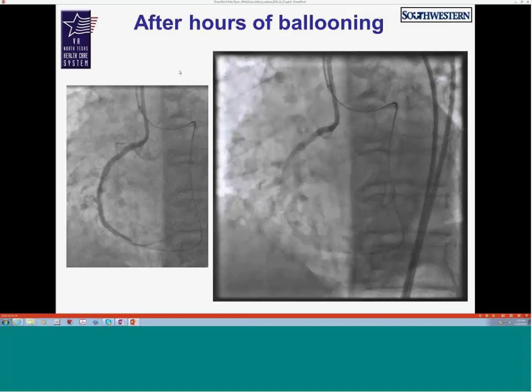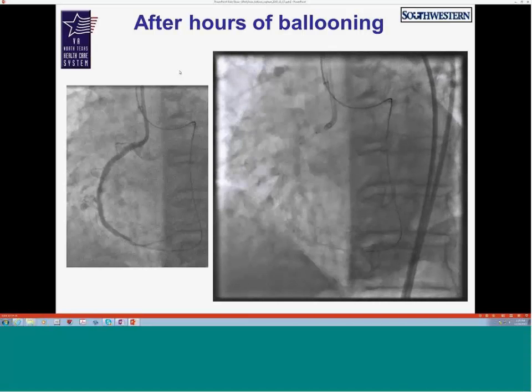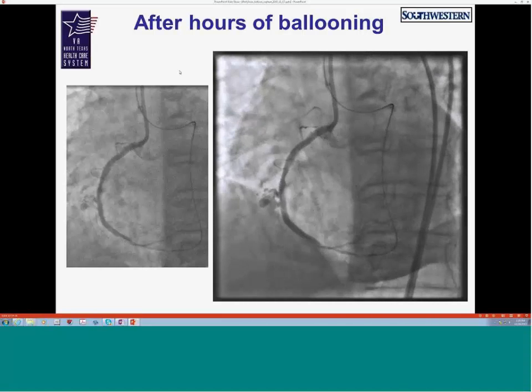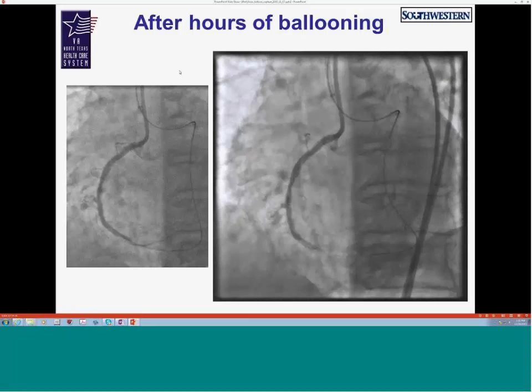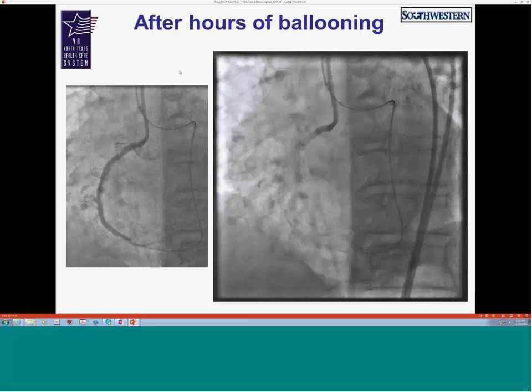So I don't know if there are any thoughts right now. We're now probably 4 or 5 hours into the case. And have you reversed yet? Not yet. The ACT by now was around 250. It was about 360 or so when we started, more than 350, and now it had come down to about 250 or so at this point.